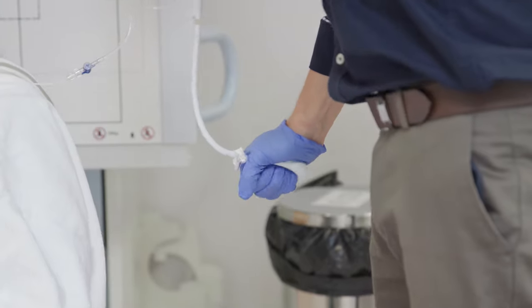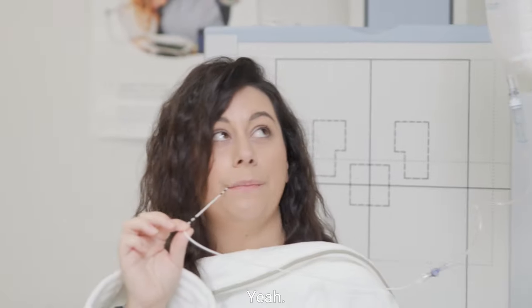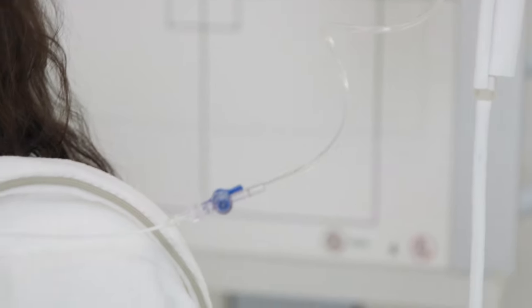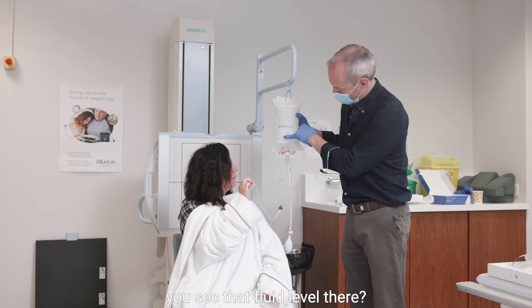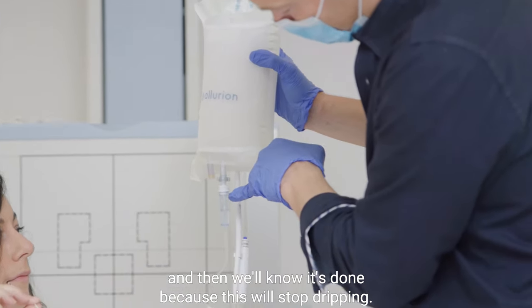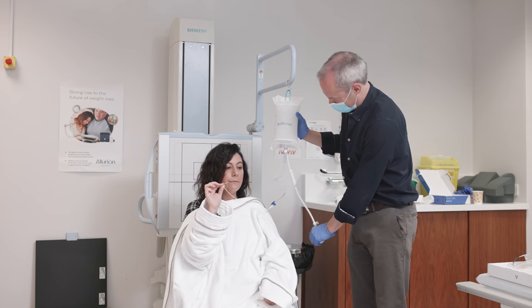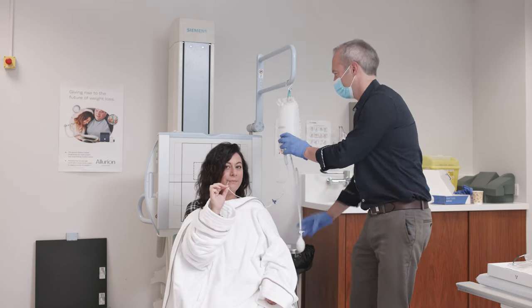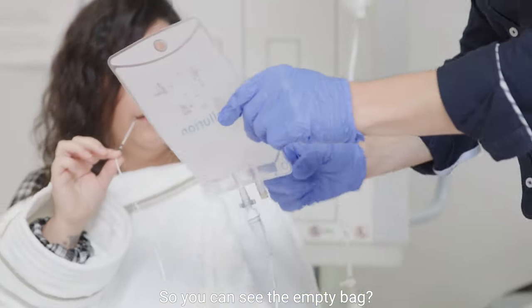You're doing really well. Are you feeling that? We're coming to the final 30 seconds. You see that fluid level there? We've gone right down from the top here down to here, and that's just going to end here — we'll know it's done because this will stop dripping. You're literally in the last 10 to 15 seconds now. That stopped dripping, and that's the last little bit there — so we just shut that off. You're all done. You've had 550 mils of fluid.